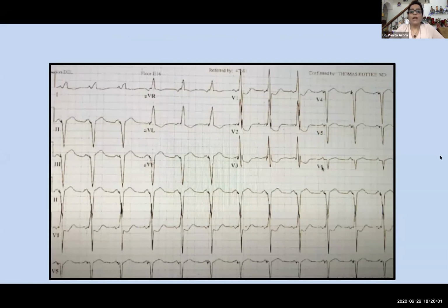If we see an ECG like this, there is another example of biventricular pacing. Look at V1. The V1 is all positive. If it is all positive, it is pacing the LV. Leads 2, 3 and aVF are negative, which is good, but look at lead 1. Lead 1 is again positive. This has to be the middle cardiac vein, and unless it's a really lateral site in the middle cardiac vein where you can place it, you cannot correct this.